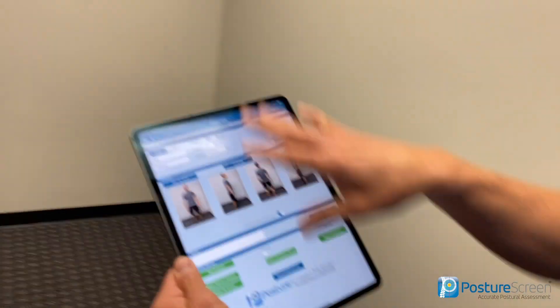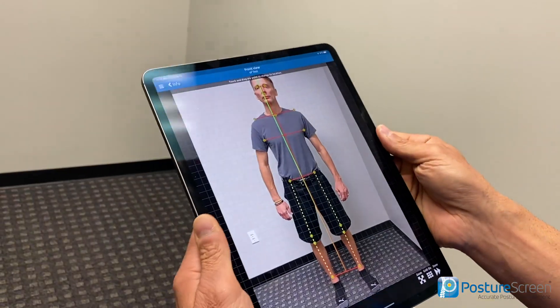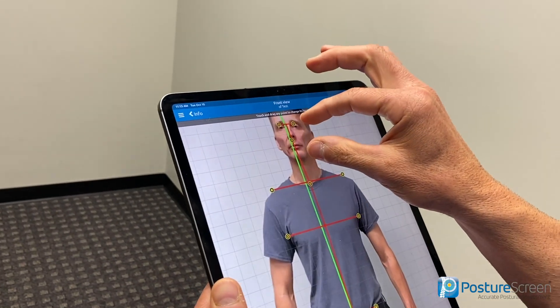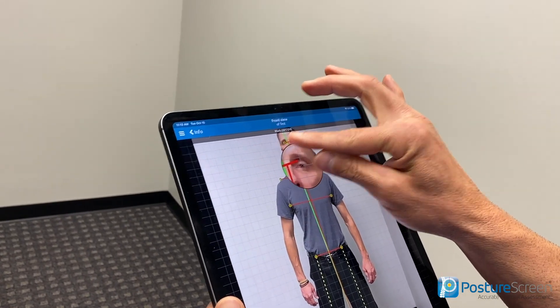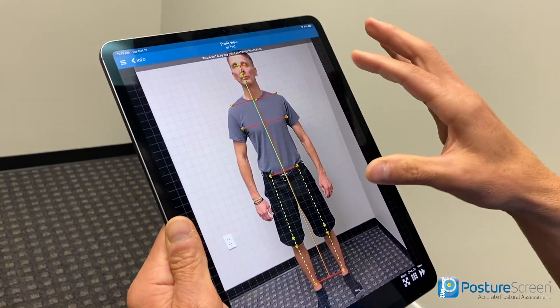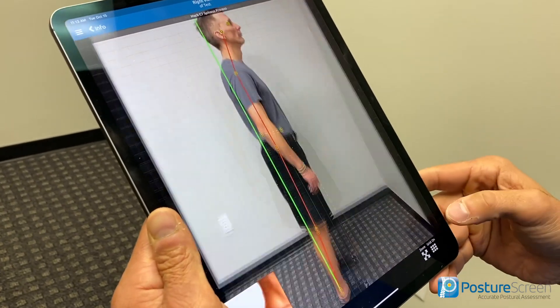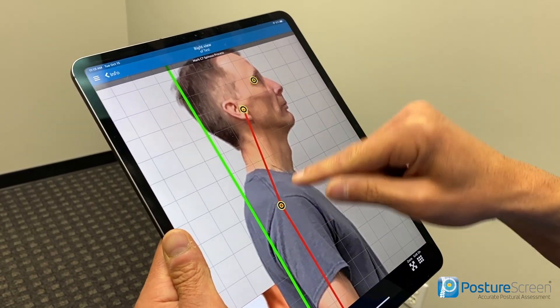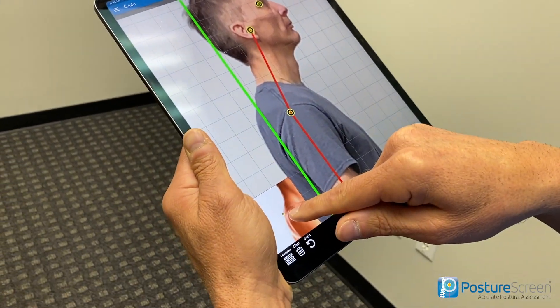We're going to manually click some points, so let me show you how that works. I have the assessments already done with the captured photographs. We'll hit 'Begin Posture Analysis.' Everything looks good here. Like I showed in the other video, if I want to change anything — for instance, if it missed his eyes just a little bit — I can move the point down. I can move the shoulder down as well. Obviously, if we have the shirt off that's much better and more accurate.